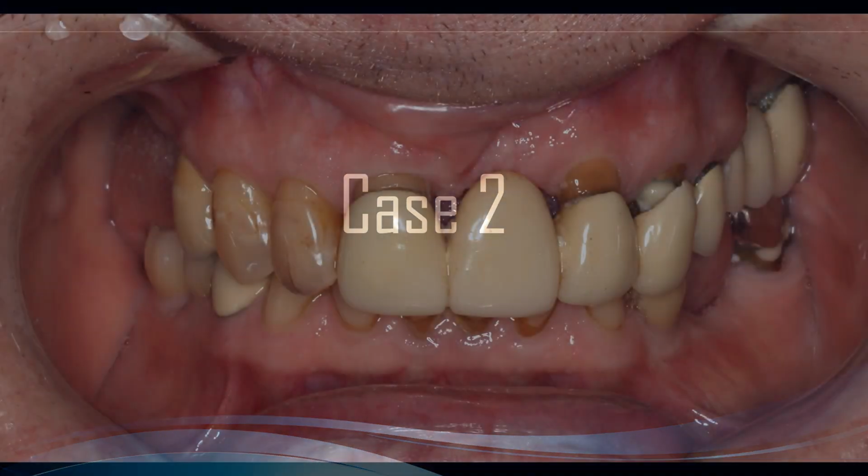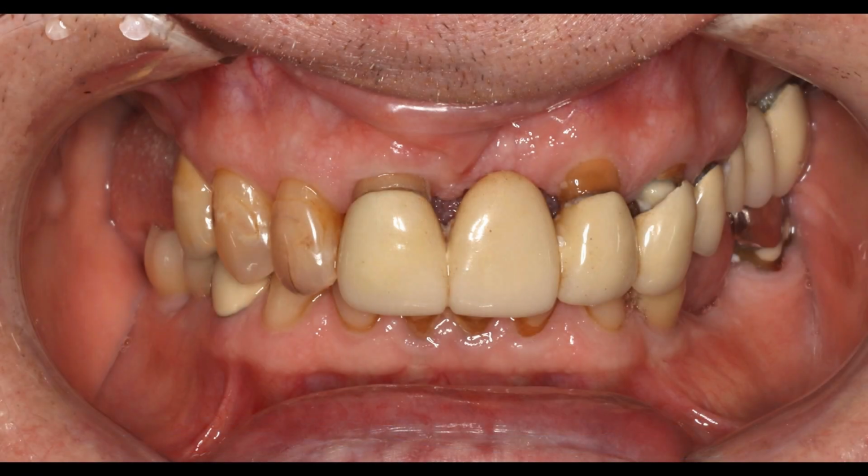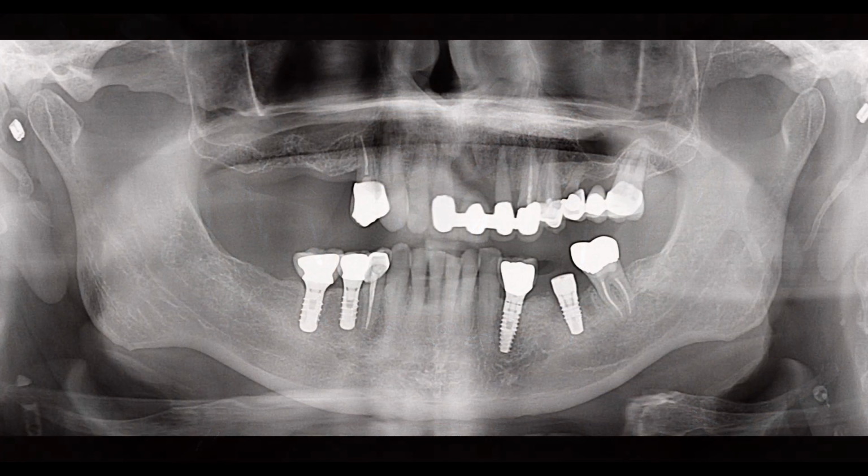Next up is case 2. This gentleman presented with failing upper dentition. But again, what I'm looking at here is the perceived amount of bone and soft tissues, which I believe to be quite good in his case, even though he's lost some bone around some of his front teeth. His soft tissue health and his connective tissue volume are excellent. Here's his pre-treatment panoramic image.